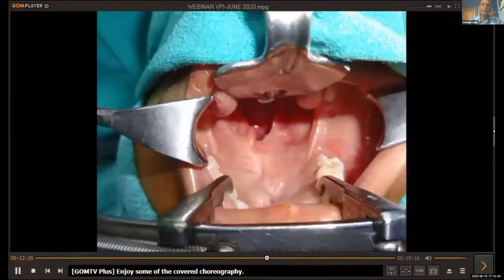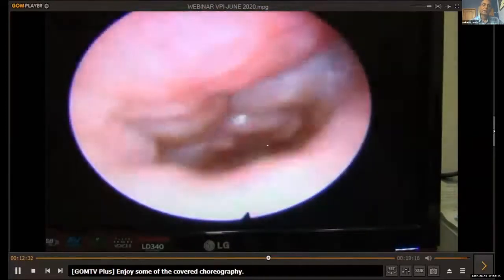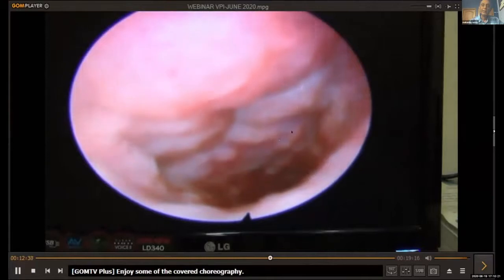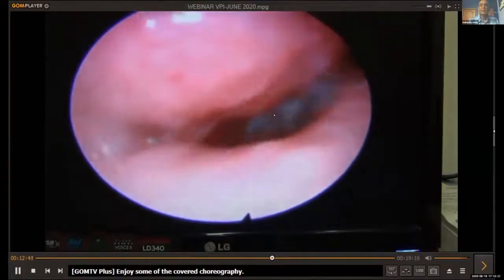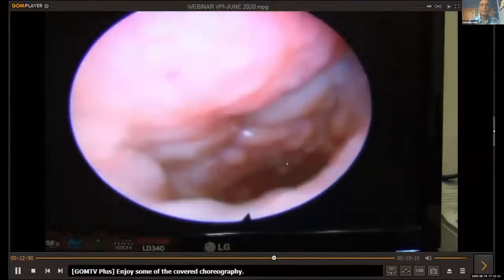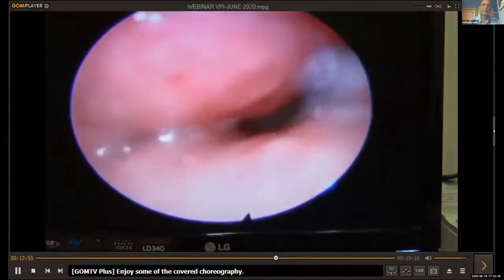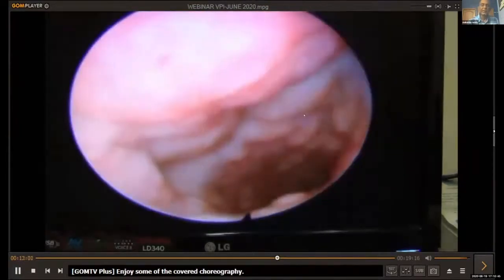There is nasal grimacing, slight hypernasality. This is the palate. You see, this is shorter. This is quite short. But the gap, there is a central small gap. This is bigger. The gap is slightly more than what we had shown earlier in the two cases. This is a central small gap. There is reasonably good movement of the lateral wall, and there is no movement from the posterior pharynx. It doesn't move.